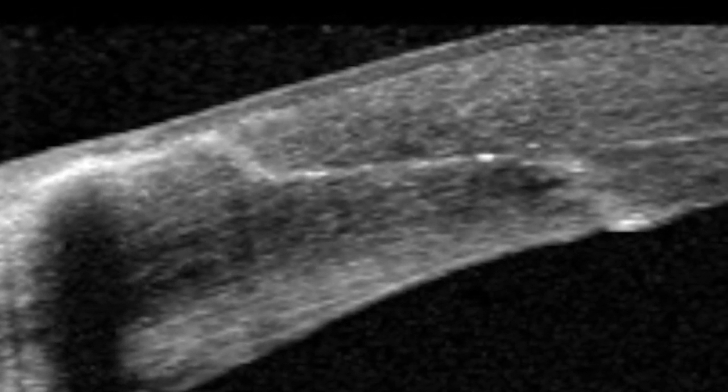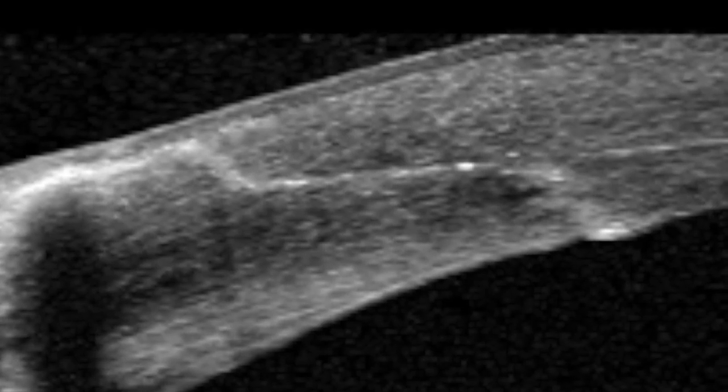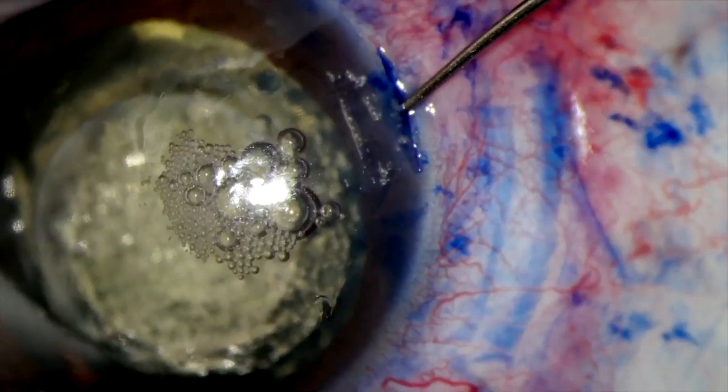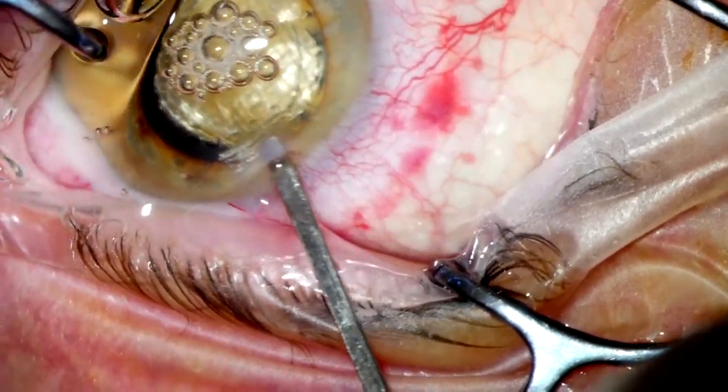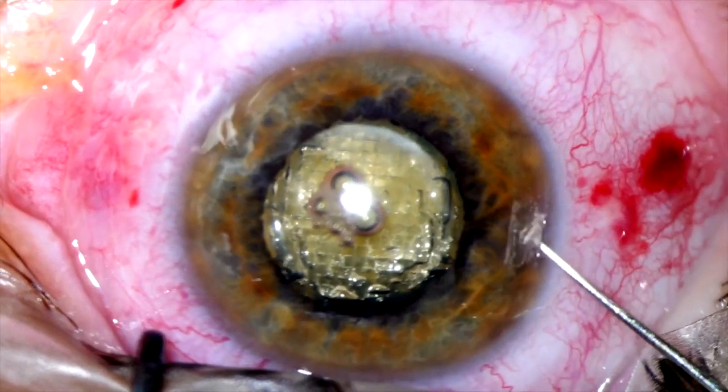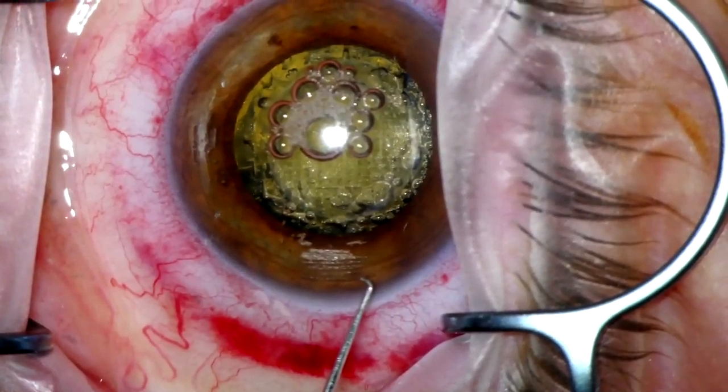Even carefully well-crafted manual incisions do not offer the same precision regarding size and design. Although three-plane manual incisions may try to achieve a standard, what usually happens is a great variation in size, length and design. After establishing these parameters, we retrospectively reviewed the video footage of 150 cases in order to evaluate success in opening and time of opening of the incisions. We also retrospectively reviewed 100 cases for surgically induced astigmatism.